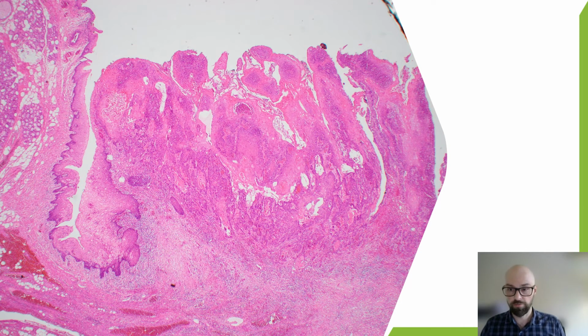This is another one from the border of the lateral tongue, and this one's not quite as easy. You can see the floor of mouth mucosa comes off at a 90-degree angle. So measuring from the base of it, where the normal mucosa starts, doesn't really make much sense because you would end up with a depth of invasion of 0.